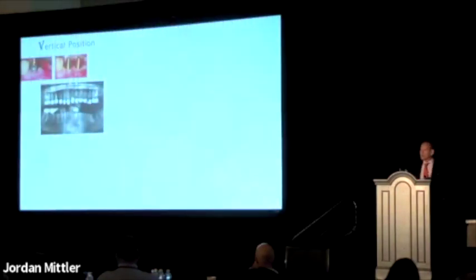Now, implant depth is also associated with tissue thickness. I often say, implant tissue thickness is both vertical and horizontal. Horizontal thickness of tissue is dependent on horizontal thickness of bone. Vertical thickness of tissue is dependent on how deep the implant is. It's all related to implant position and very little to do with biotype. I know this may sound controversial, but it isn't. So if you want thick vertical soft tissue, you have to place the implant deep.